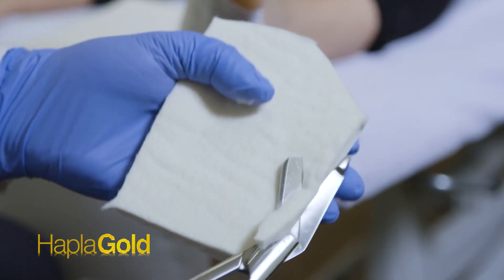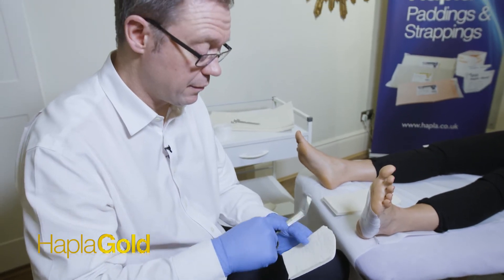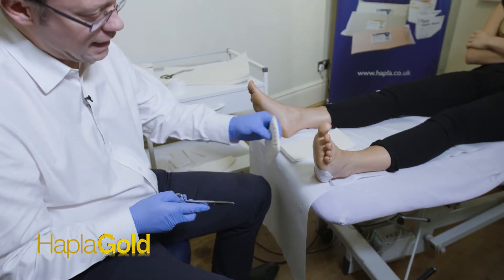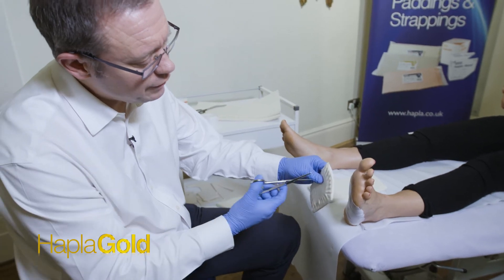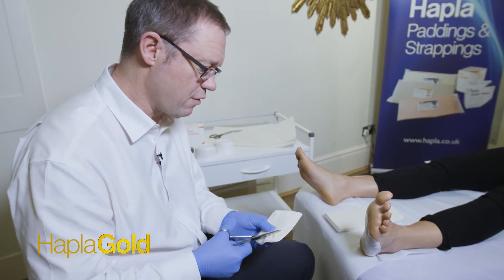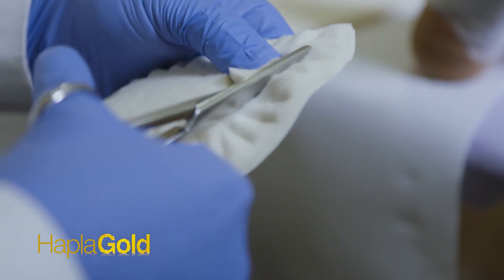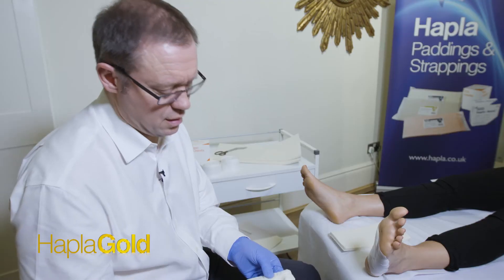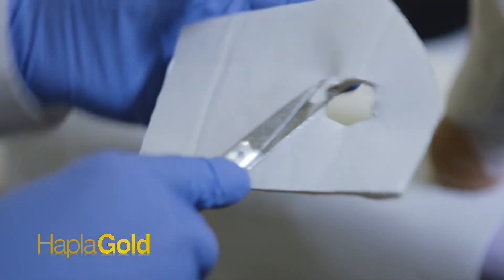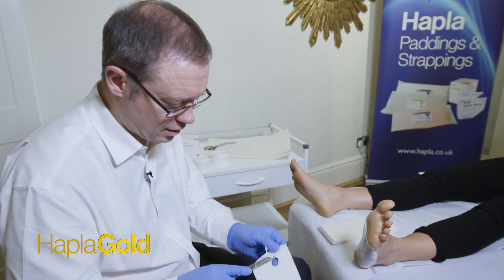On this we create a 45 degree bevel around all the sides, then pie crust bevel all the way round the plantar slab. Once pie crust beveled, we place this close to the foot and find out roughly where we need to sight the aperture. We caress the scissors through and cut out the aperture slightly larger than the ulcerative site. As we cut round the aperture we leave a 45 degree bevel around the outside, and we also under-bevel slightly the aperture so that we don't create a ring of pressure around the ulceration site.